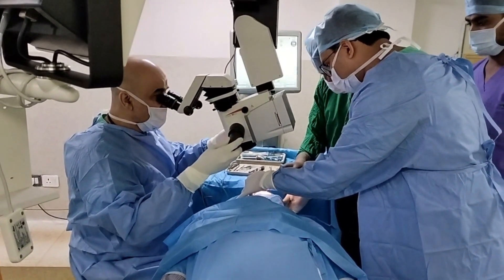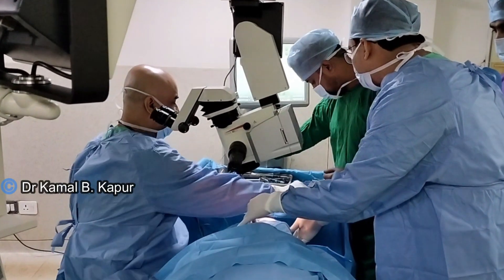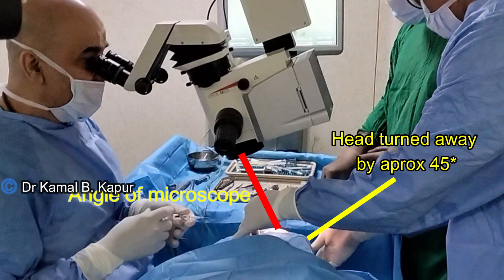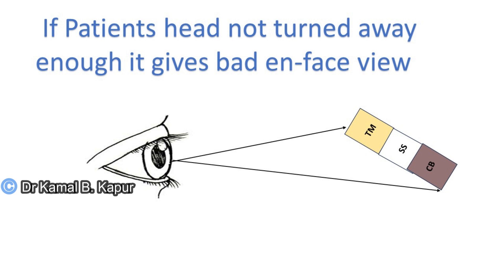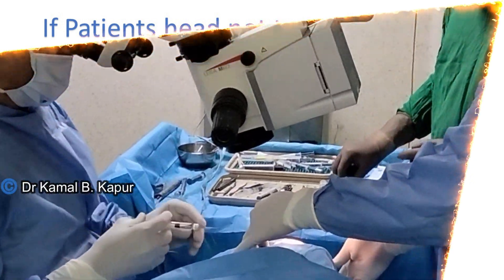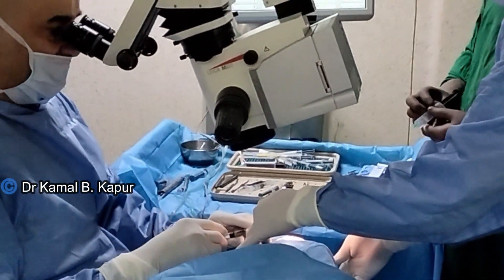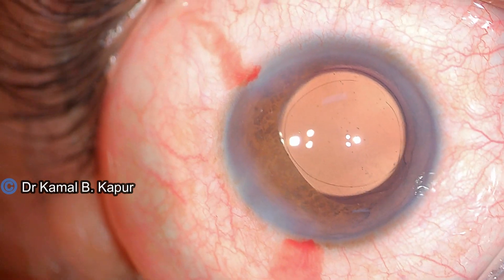It's a very good idea to have somebody hold the patient's head away from the surgeon so there is an angle of approximately 80 to 90 degrees between the microscope and the patient. If this is done properly, we will get an en-face view of the trabecular meshwork, the scleral spur, and the ciliary body. But if the rotation of the head or the microscope tilt is not adequate, all three structures will appear collapsed and separating each one of them will become tricky. So it's very important to have a microscope that can be tilted and an assistant who can turn the patient's head.